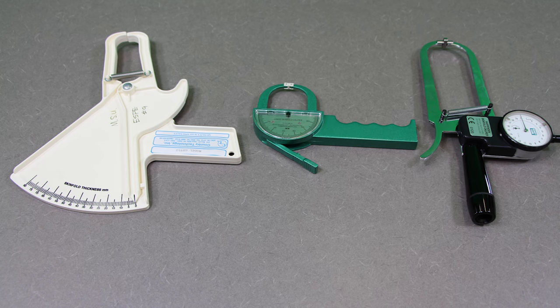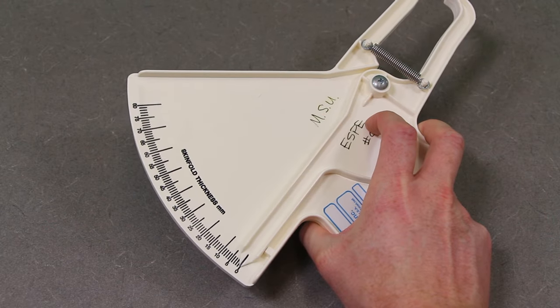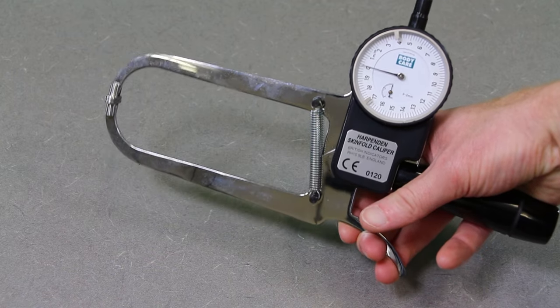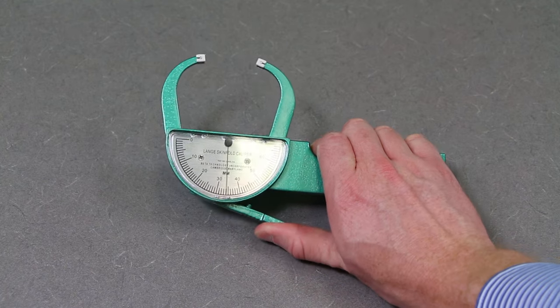There are several types of skinfold calipers out there. The most commonly used ones are going to be the Lange calipers, and that's what we're going to be using today. But you might also see the Country Technology type calipers or the Harpenden calipers. Both of those are used in different institutions worldwide, but again, the Lange is the most common one.